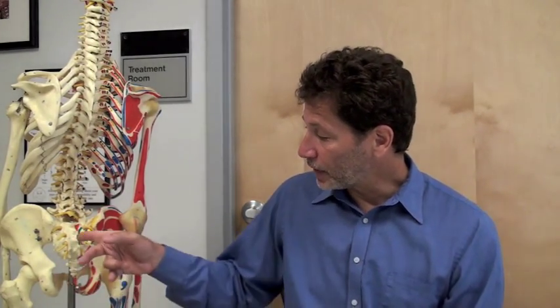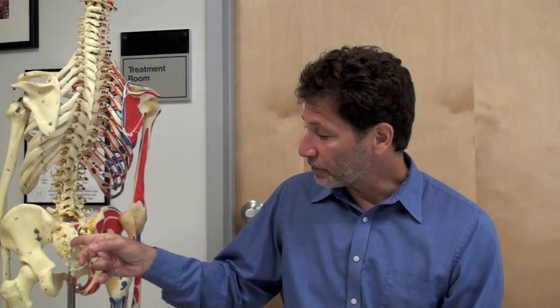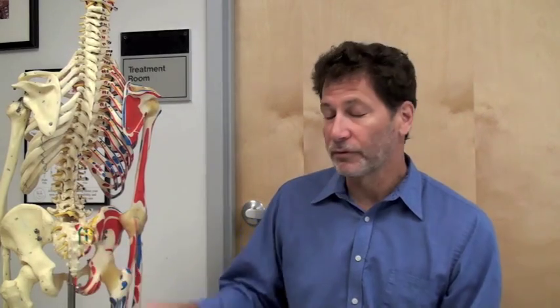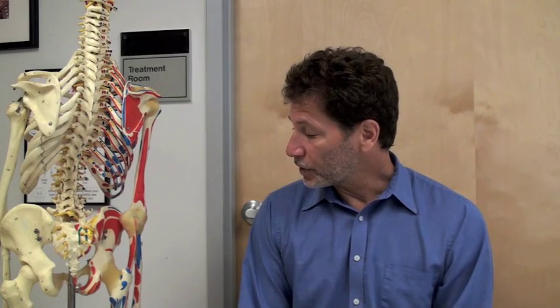After anesthetizing the skin and structures below the skin with local anesthetic, we'll enter the epidural space from the caudad position. We confirm our position with fluoroscopic X-ray guidance, and once we do so and are happy that the needle is in the correct position, we then go ahead and put our medicines into the epidural space.